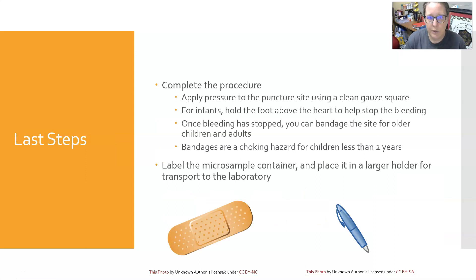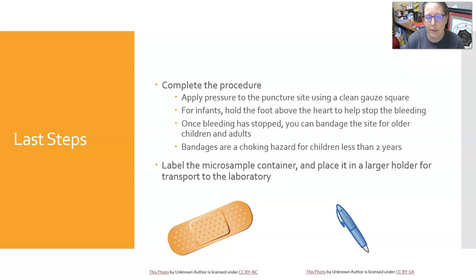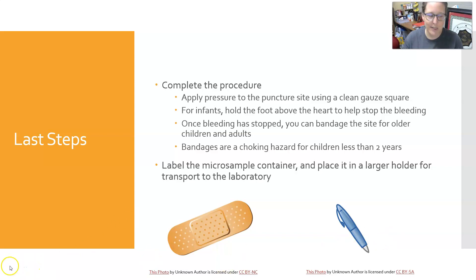To complete the procedure, apply pressure to the puncture site with a clean gauze square until bleeding stops. For infants, hold the foot above the heart to help stop bleeding. Once bleeding has stopped, bandage the site for older children and adults — but bandages are a choking hazard for children under two years. Finally, label the micro sample container and place it in a larger holder for transport to the laboratory.